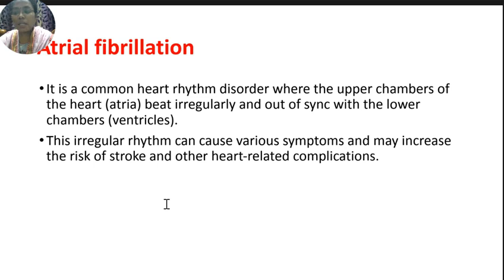Okay, and the shortened PR interval. The shortened PR interval represents a disease called Wolff-Parkinson-White syndrome. Wolff-Parkinson-White syndrome is a heart related disorder. If we treat it at an early stage, we can save the patient and reduce the mortality rate of the person.